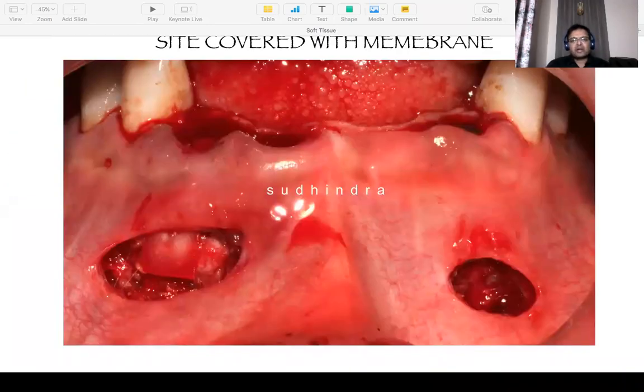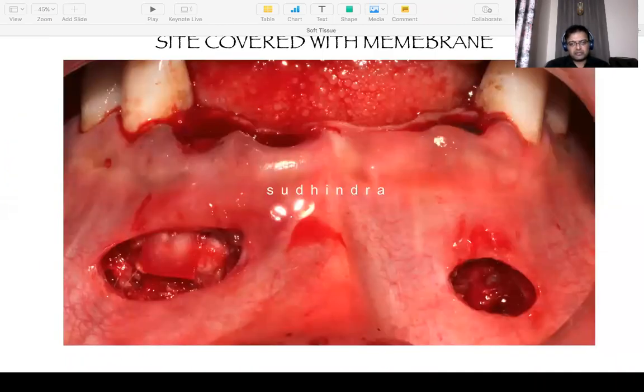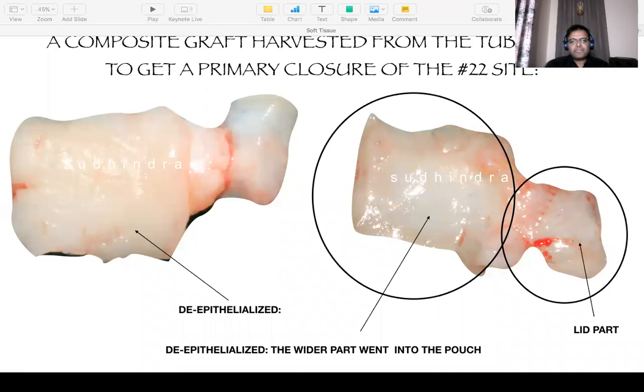Okay, now because we had extraction sites there, and I already had made an incision in the aesthetic, I still had to close those extraction sockets. Okay, doing a palatal roll was out of the question because I could not advance the flap so much. So what we did was we did a free graft. We took a free graft and sectioned it into 2 parts.